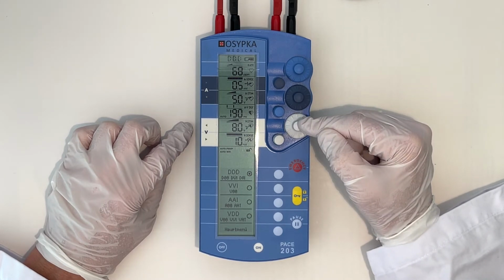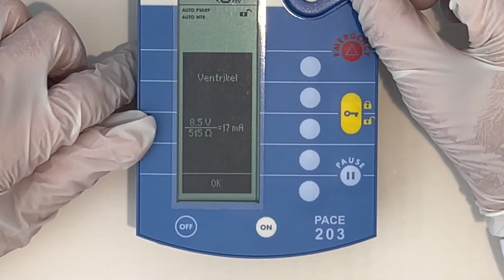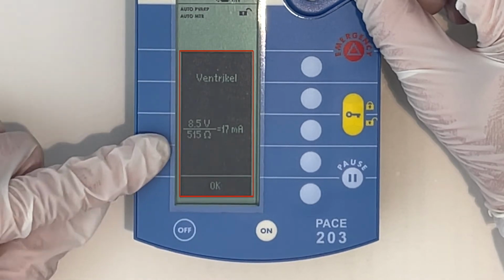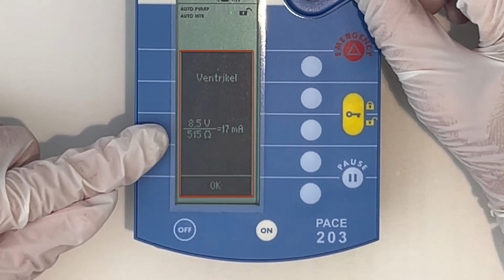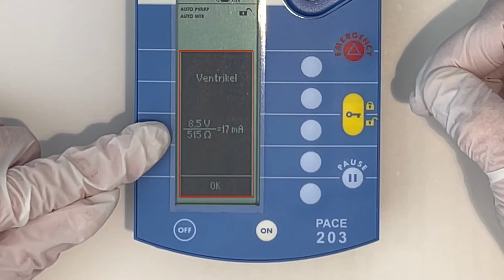This also works when the device is locked. If you turn the controls for the ventricular stimulation amplitude briefly, you can see the information here in the display. Ventricle, and an equation with Ohm's law. The value above the fraction line is the stimulation amplitude in volts. The value below the fraction line shows the measured impedance. It is given in ohms.